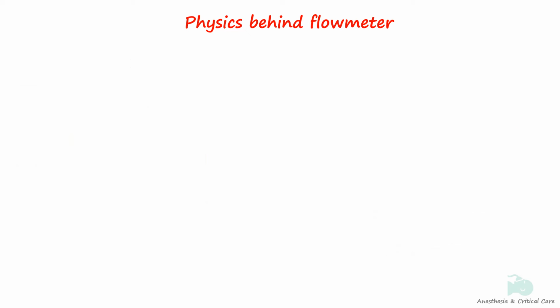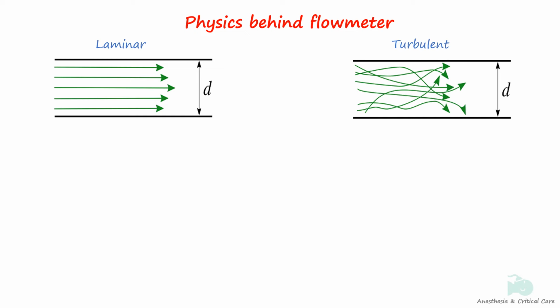Fluid flow can be either laminar or turbulent. Laminar flow is the movement of fluid particles along well-defined paths or streamlines, where all the streamlines are straight and parallel. Viscosity is the determining factor for laminar flow. Turbulent flow is defined as the flow in which the fluid particles move in a zigzag way. It is often present where there is a sharp bend or some other irregularity which may cause a local increase in velocity. Density is the determining factor for turbulent flow.